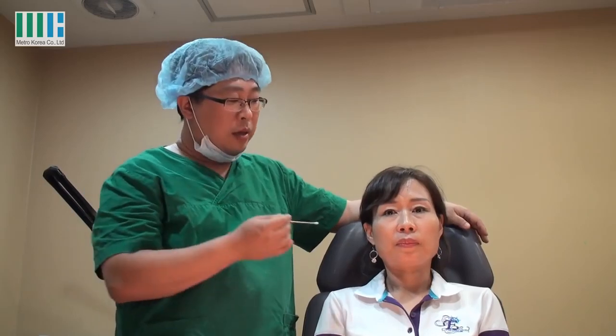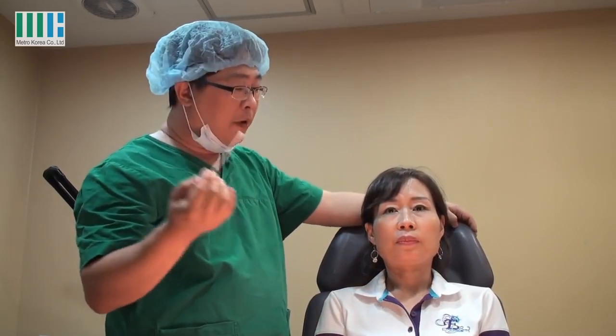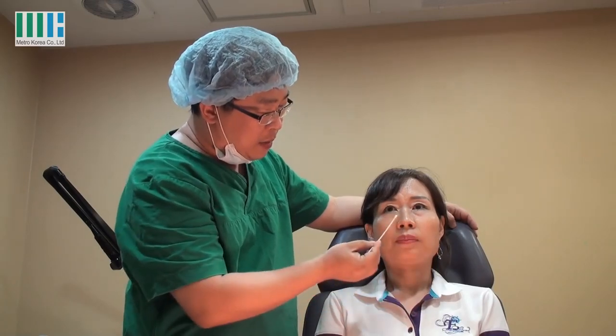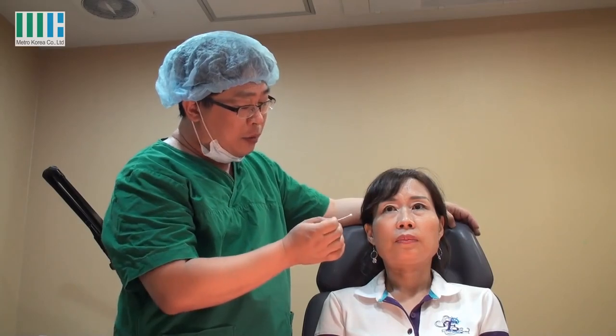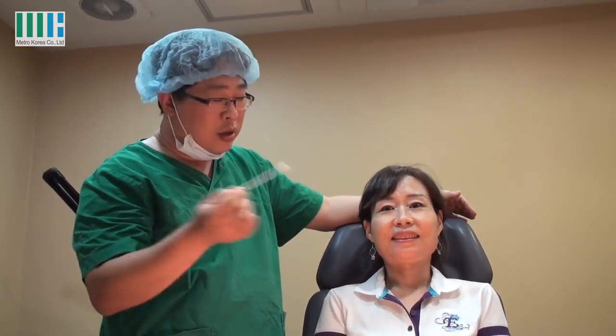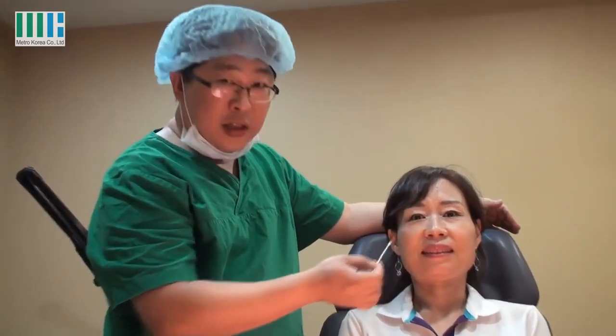She has a nasolabial fold, and she is only 49 years old. You can see there are some folds that rise here. The nasolabial fold is here, and it is very low. When she smiles, she has a groove, and the wrinkles become deeper.